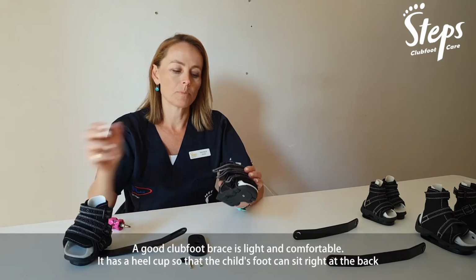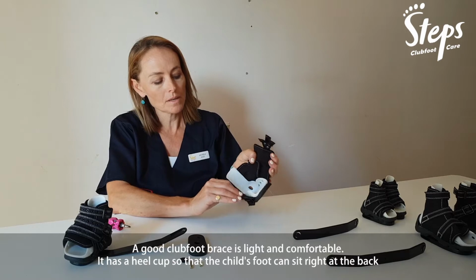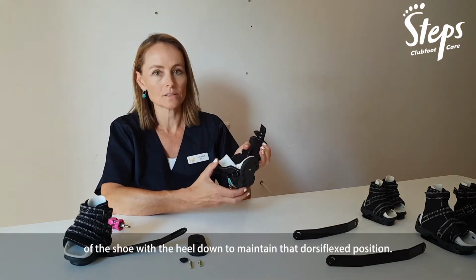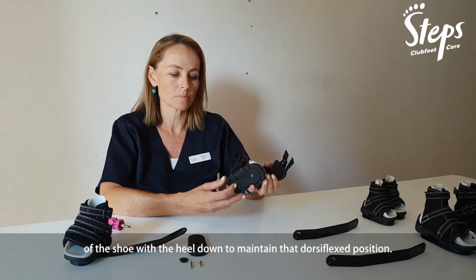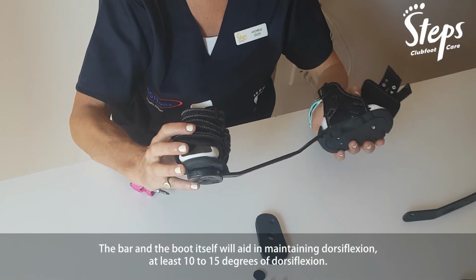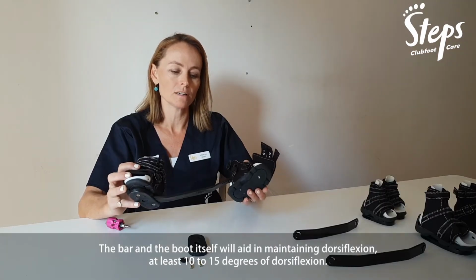A good clubfoot brace is light and comfortable. It has a heel cup so that the child's foot can sit right at the back of the shoe with the heel down to maintain that dorsiflexed position. The bar and the boot itself will aid in maintaining dorsiflexion, at least 10 to 15 degrees of dorsiflexion.